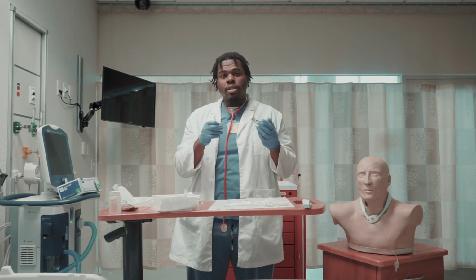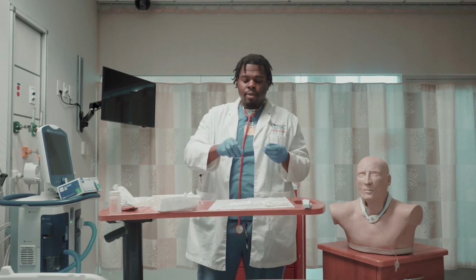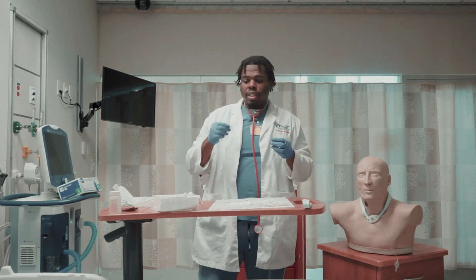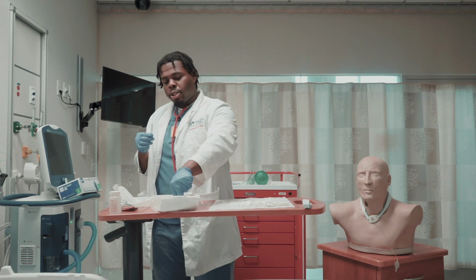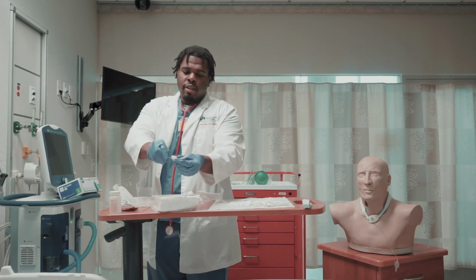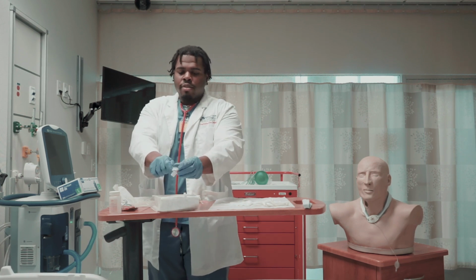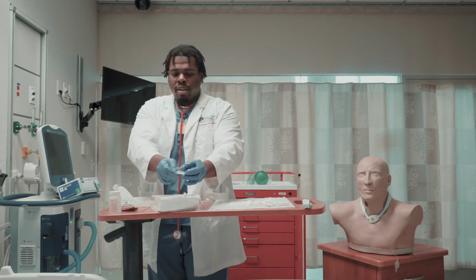For today's purposes, we're going to work with a non-disposable inner cannula. Pick up your brush, dip it in the hydrogen peroxide and water, put it inside, scrub really well inside, then scrub outside, keeping it over the hydrogen peroxide as you're scrubbing.